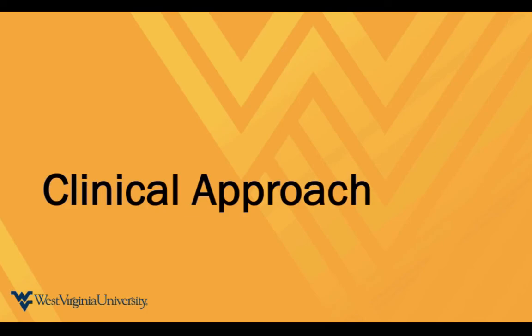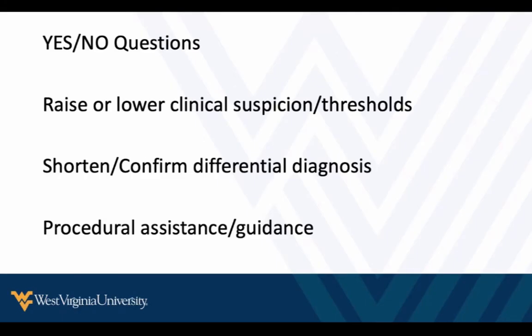And then a little bit about just the clinical approach to ultrasound and point of care ultrasound, and how it's different from comprehensive or radiology ultrasound or other imaging specialists. Most of the time you want to go into this with an approach of a yes or no question, or trying to evaluate a specific syndrome of why is this patient dyspneic, or why is this patient having this right lower quadrant pain. A lot of times that's yes or no questions.